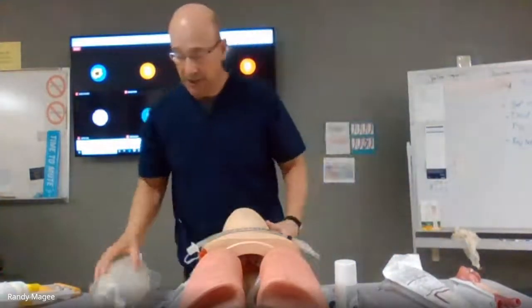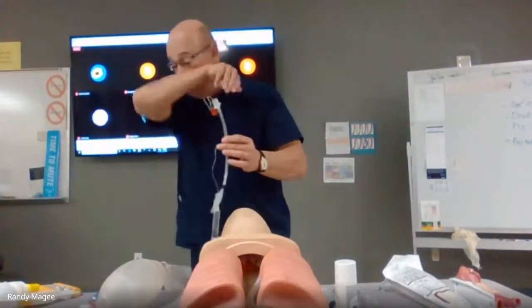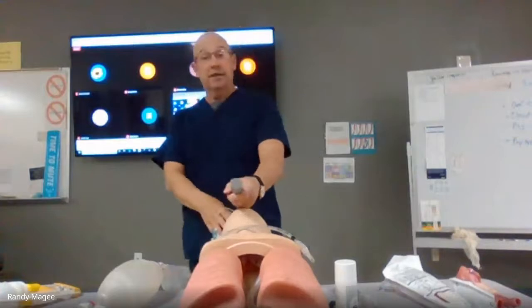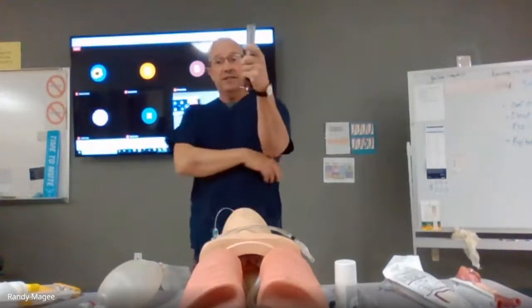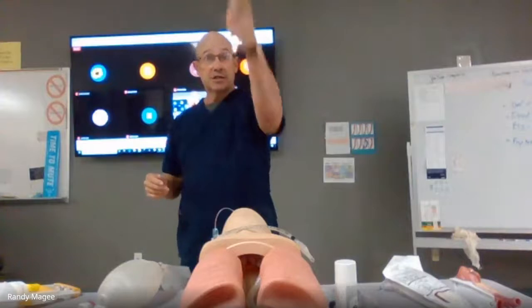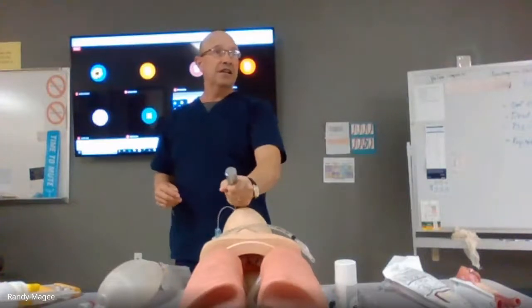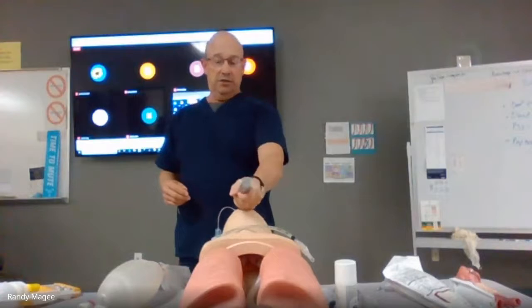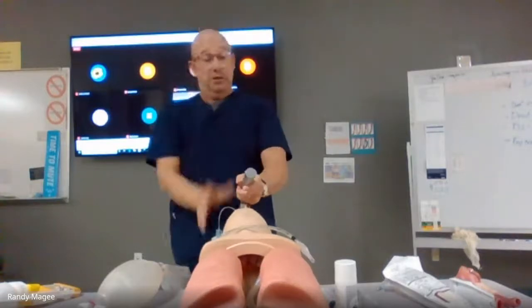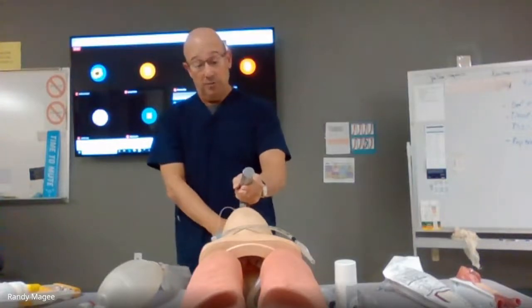Okay. So I'm going to pre-oxygenate the patient, have my suction ready, have my tube, go ahead and have my 10 cc syringe attached to it. I'm going to go in for the look. Now, one thing that you don't do technique-wise, when you intubate, the handle goes towards the sky like this, like a 45. It's not one of these things where you do that. You hear that clicking sound? That's teeth breaking. So you don't pry back. It's not a deal where you pry back. It's where you push forward. You take this and you push the jaw up forward, like so. This is what requires the forearm strength.